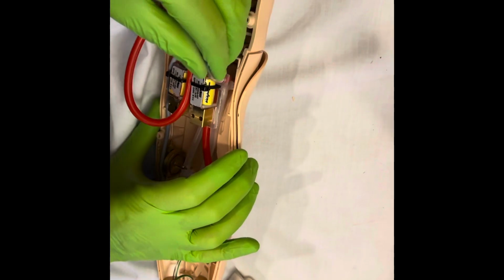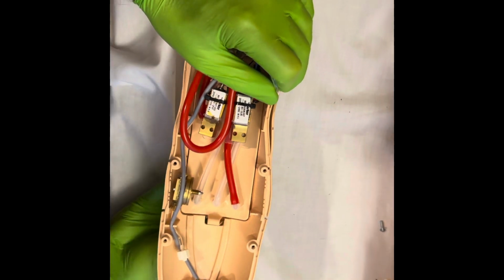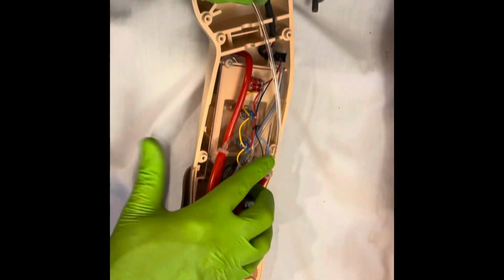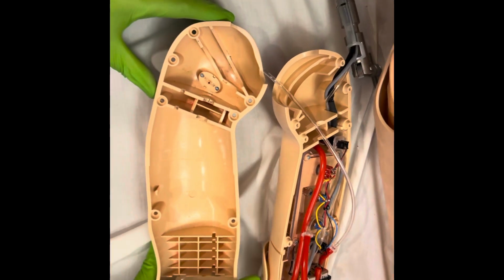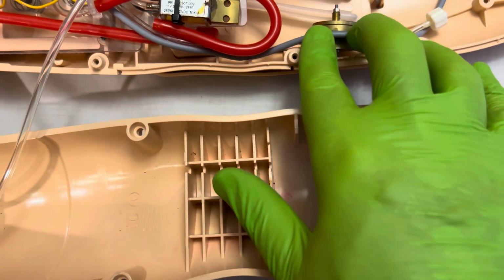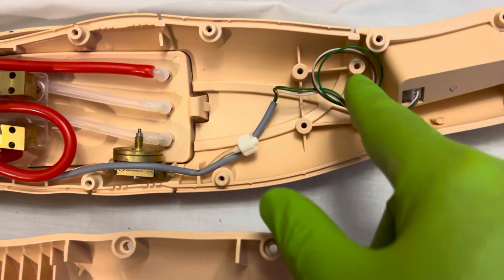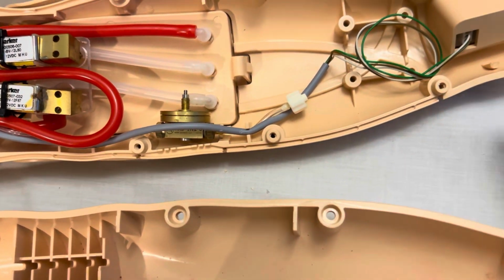And then our exit needs to come up and over here. And this will go to our exit bottom case. All right, now that our hose is connected at the exit port here, we're going to make sure that we don't have any wires or hoses that are going to end up in the contact point for where we screw the arm casing back down. This wire did move on me, it was up over here, so again, make sure that stuff is not going to make contact along this rim here.